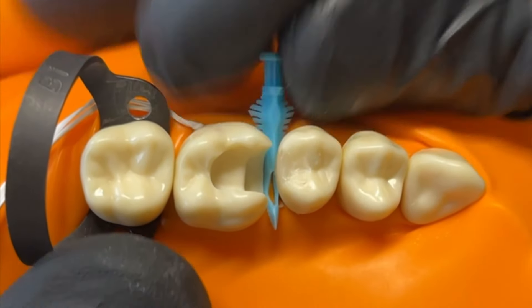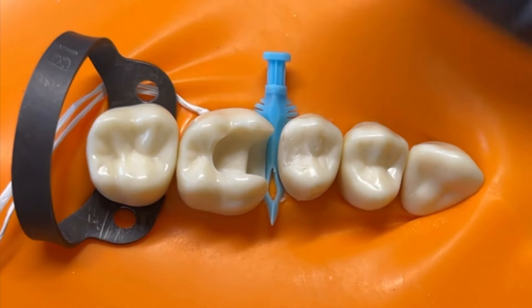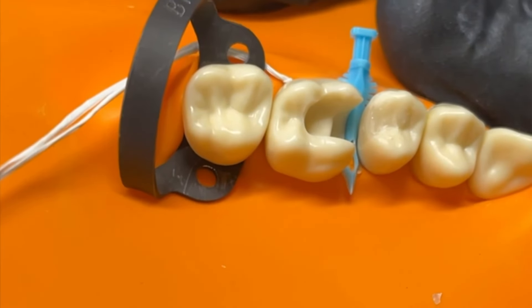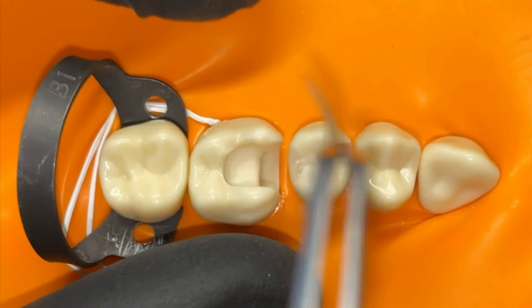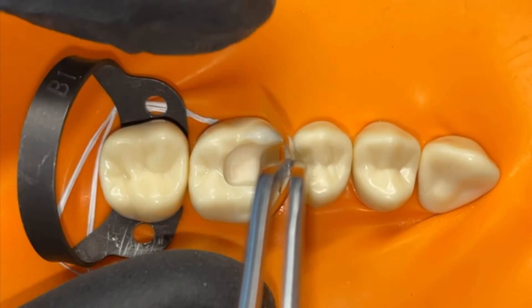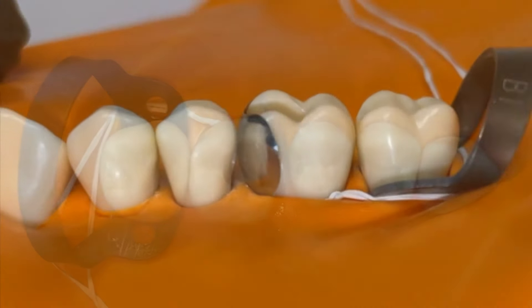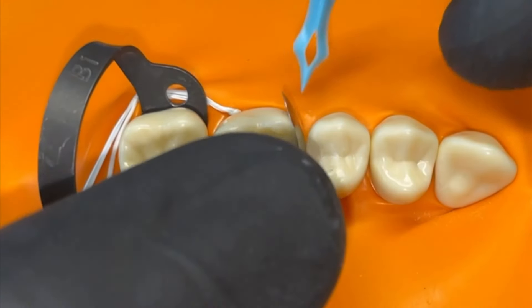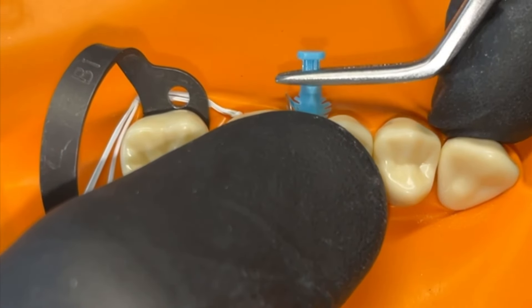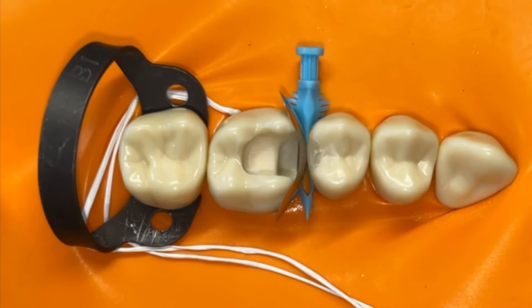Now we're back to familiar ground with just a classic class two. We're going to find a wedge that fits appropriately without causing matrix distortion. We're going to use a Torvian double-curve band — I'm a little biased, but you can't beat this band for the contact profile it develops. As long as you've got a good enough bridging gap, it's my go-to, and then we can get the wedge placed.